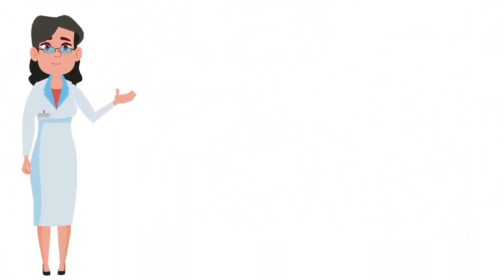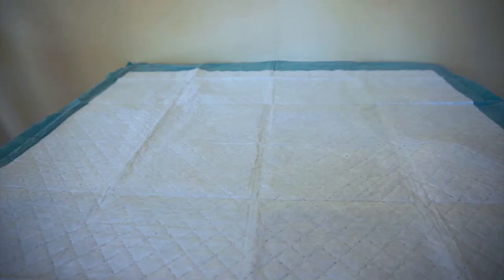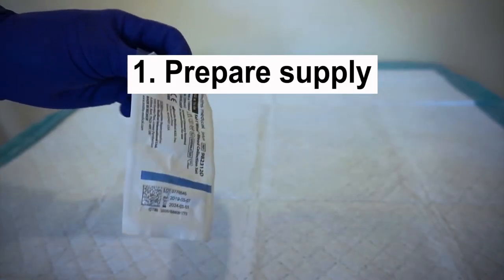Now, let's discuss what's going on in the video and the steps to properly perform venipuncture. First, prepare the phlebotomist supply.